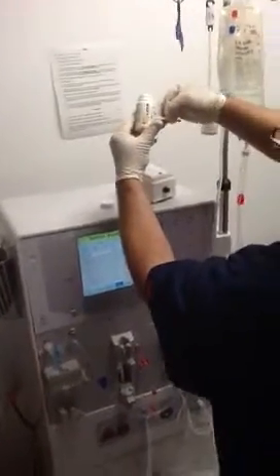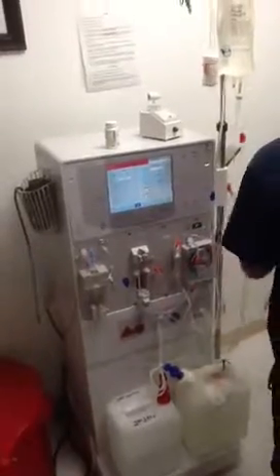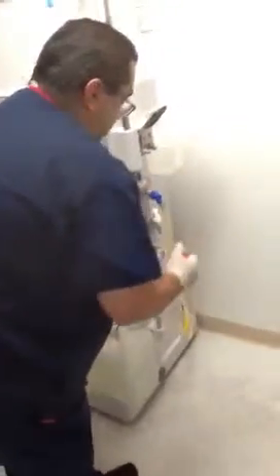Check your pH. Up here it reads 7.2 — that's good.